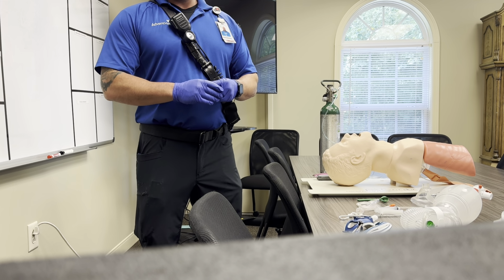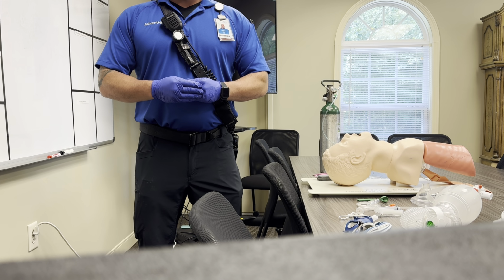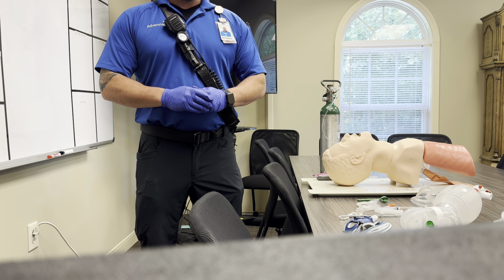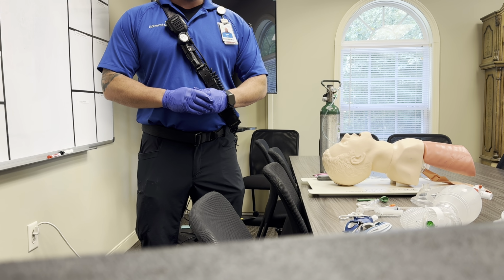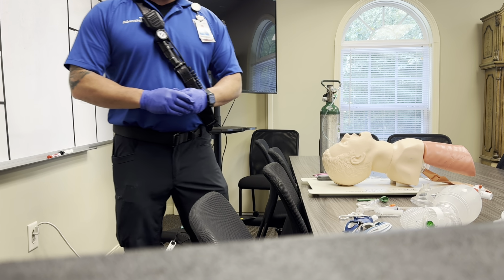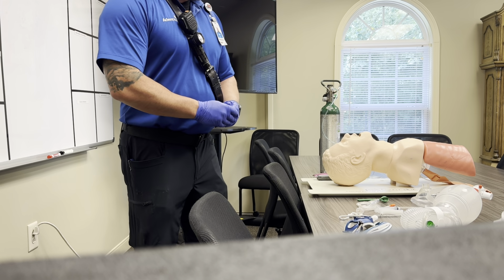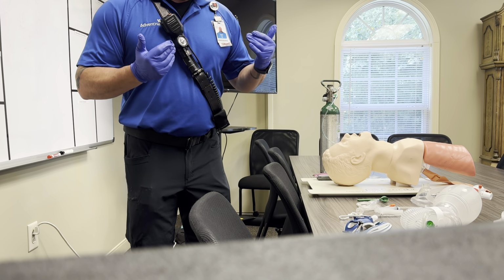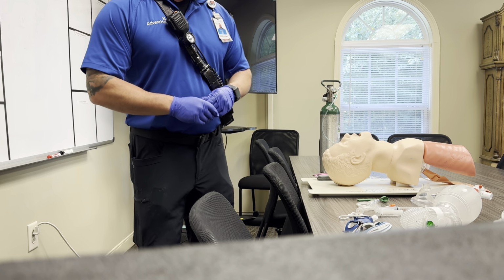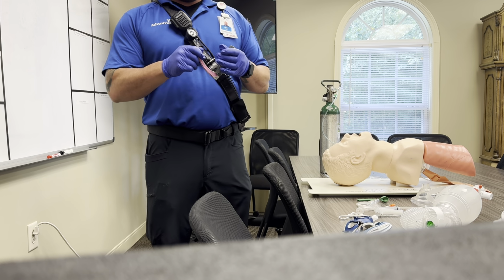Today, we're going to be going off the scenario that our patient is in respiratory arrest. It's not cardiac arrest, but just respiratory arrest. And we'll go from there following our intubation skills. So we do want to make sure we have all of our appropriate equipment. Each morning we have to check off our ambulances just to make sure that we do have all appropriate equipment and working equipment. So today we'll be using a Mac 4 laryngoscope.